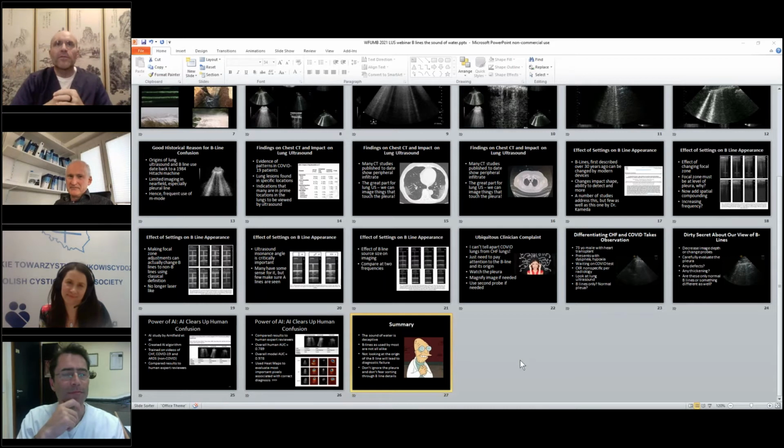I'm Michael, happy to try. So I think it would be tremendously useful, and especially for following patients, because clearly there's a body of literature establishing that changes in severity correlate with clinical deterioration. But something that's often overlooked is that these are patients that can deteriorate for other reasons.